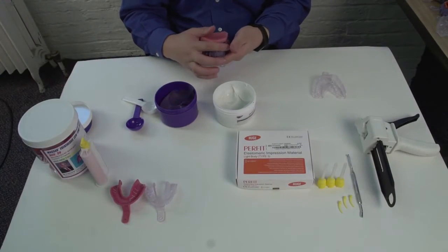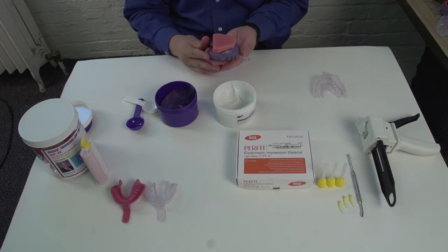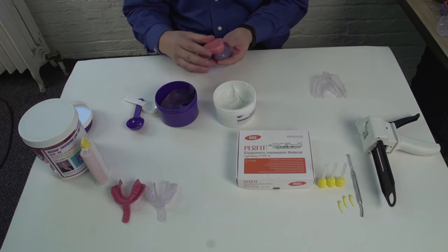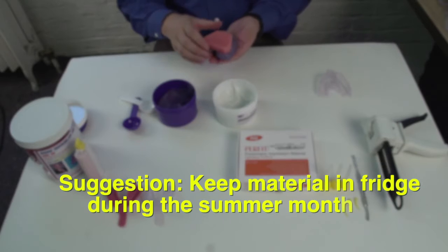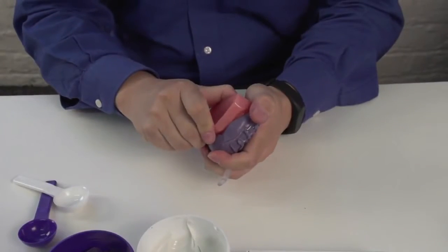Polyvinyl siloxane silicone impression material is sensitive to temperature. The higher the temperature, the faster the setting. We therefore suggest keeping it in the refrigerator in summer to extend the setting time.